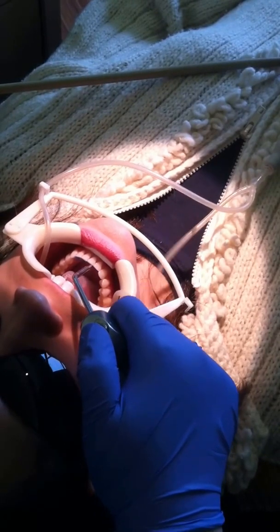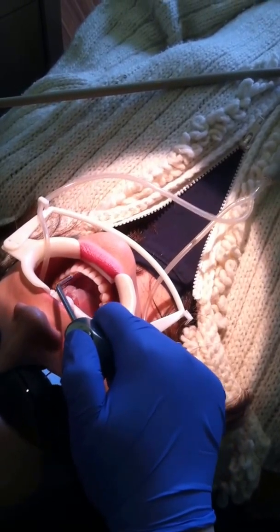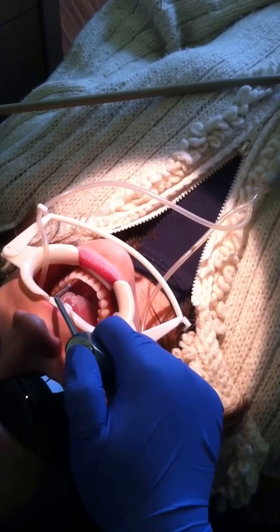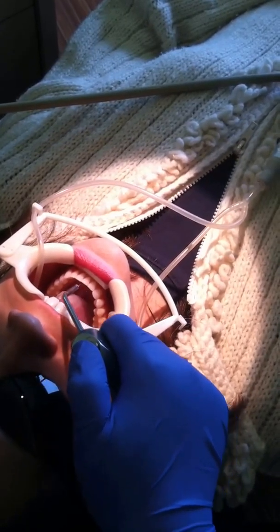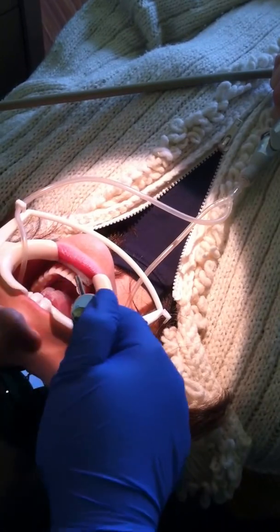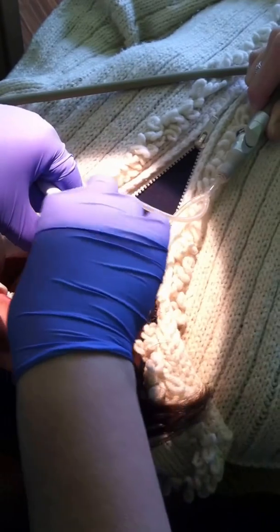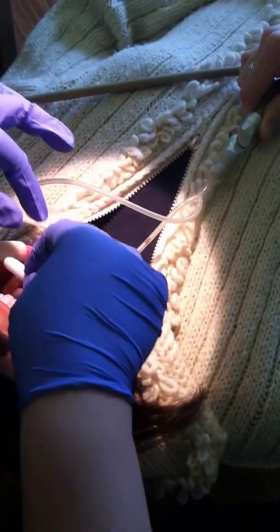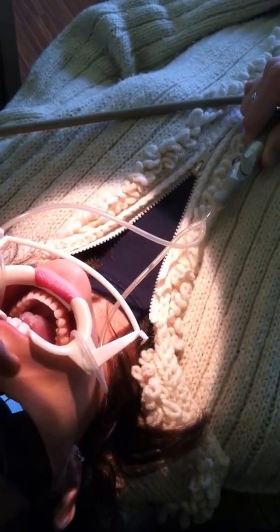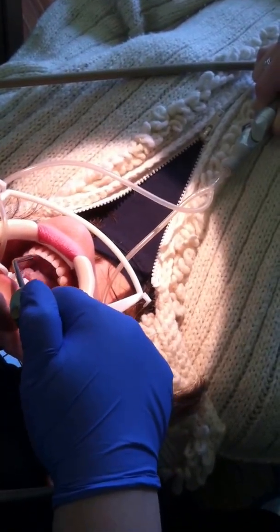Then we rinse the acid etch. This is an opportunity to rinse the lingual surface of the teeth and dry, making sure that any surface contaminants, any calculus debris, or debris that was dislodged from flossing is all rinsed out. Make sure that we've got a nice, dry, chalky surface on the linguals of the teeth.